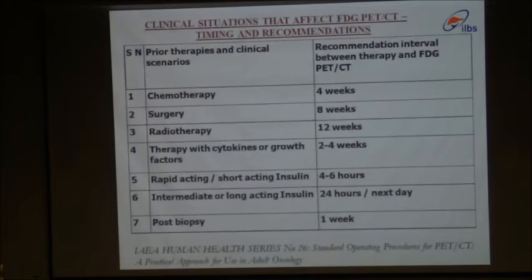Now, for the clinical situations where the FDG uptake is affected, we should have the history of chemotherapy. The FDG should not be given within 4 weeks of chemotherapy.